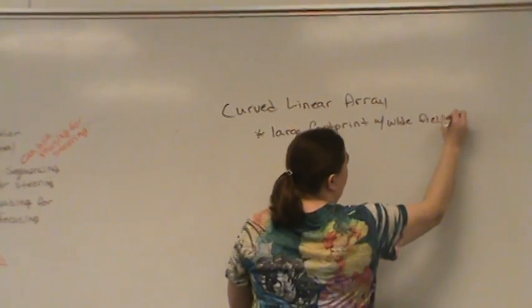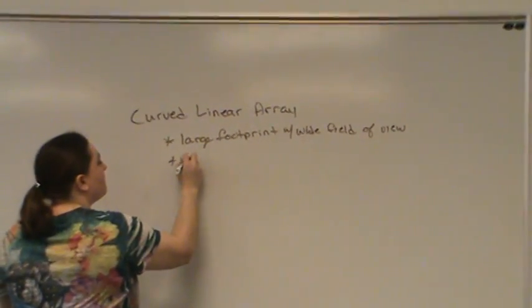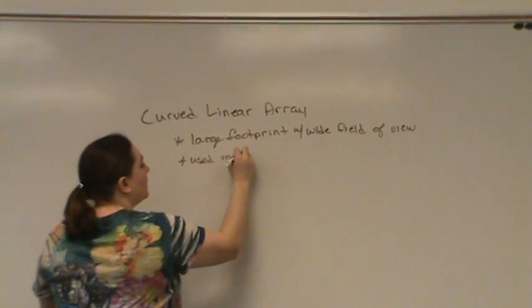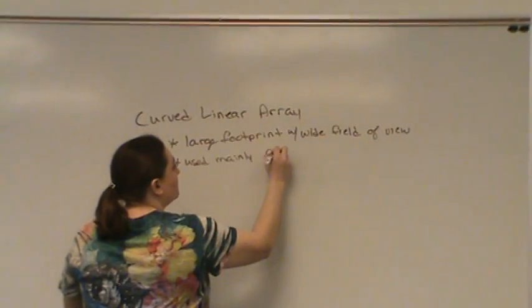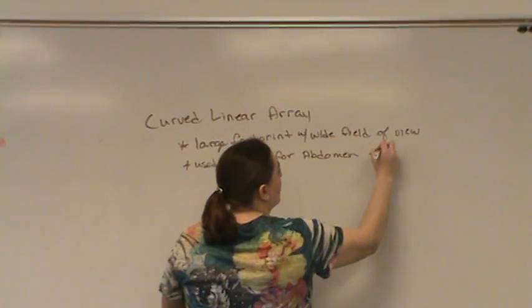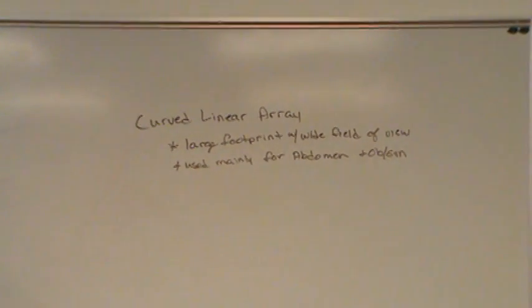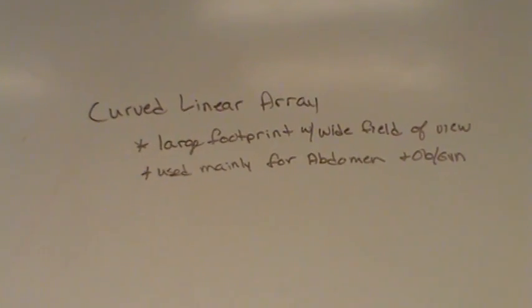It has a very wide field of view. Used mainly in the abdomen or for OB/GYN abdomen pelvis stuff.